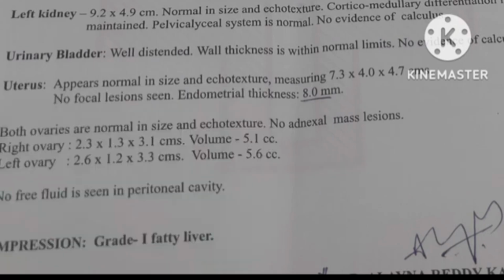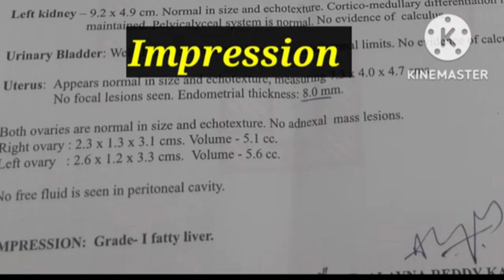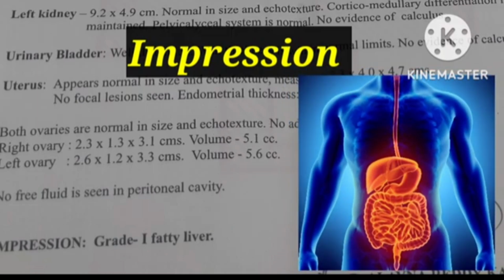Finally, the impression. How is the final result or final summary? The final summary is mentioned in the ultrasound report. This is the most important. This is all about how to read an ultrasound scan report.